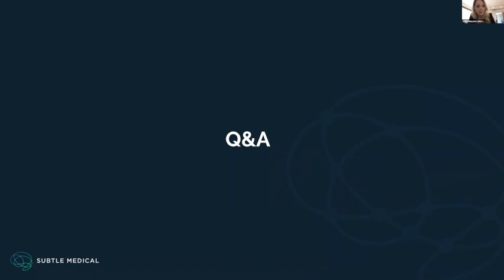Great. I think we only have one more question, and that question is, how quickly and easily can SubtleMR be deployed? That's a great question. I didn't touch upon the deployment aspect of any of these solutions. From a SubtleMR perspective, being a third-party software, it is extremely simple in the sense that it sits between the modality, which here is MR, and the PACS system. So it requires a VM to be provided by the institution. And once that VM is provided, we can do remote installation of the software, as well as remote observation of how the system is performing.